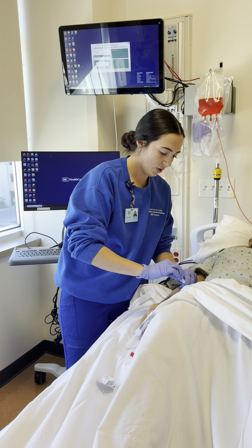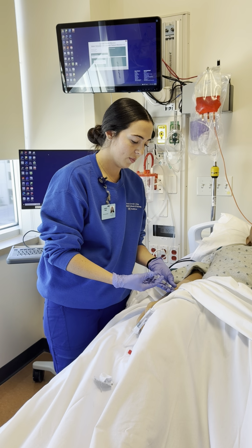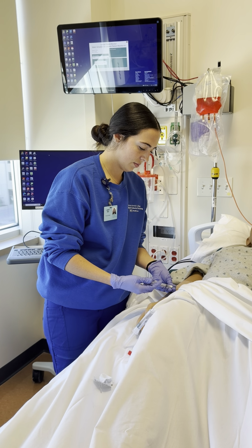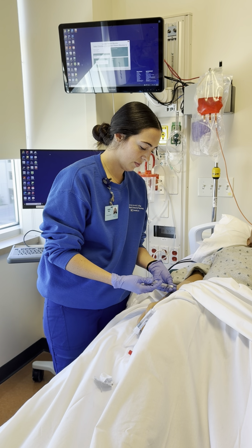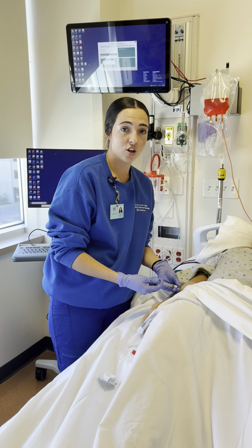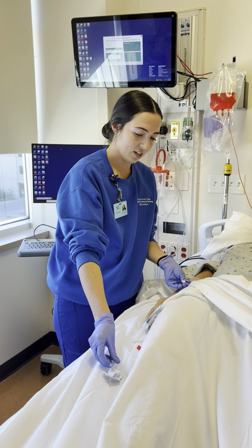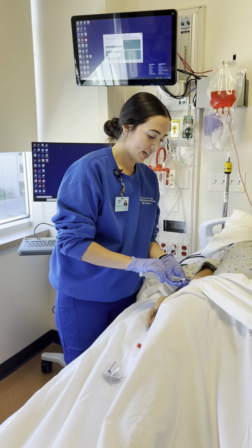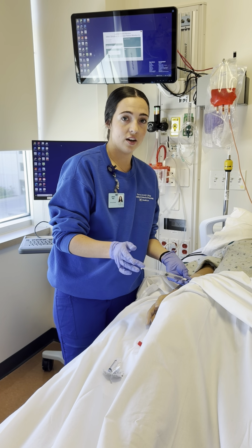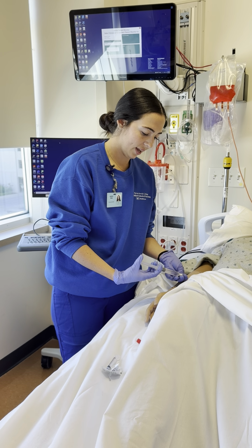and I'm going to go at a rate of 1 milliliter per minute. So we're going to do this over the course of 1 minute. So a minute has gone by. I've administered my medication. I'm going to unlock this here, and I'm going to take my sterile syringe, and I'm going to repeat this flushing over the course of 1 minute, just at the same rate that I was giving the medication. So 1 milliliter per minute.